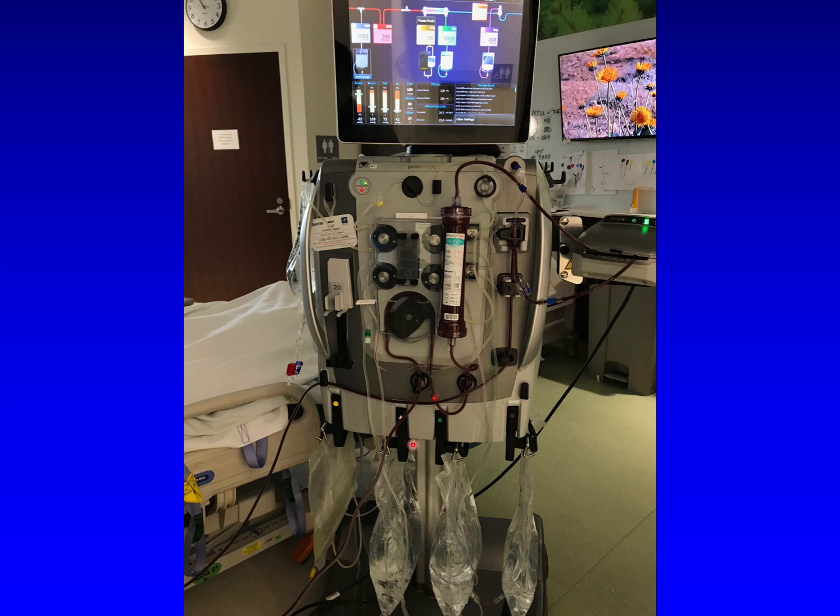Ultrafiltrate is being collected in one bag. This is what's being sucked out of the capillaries as they go through the canister. And notice how this bag is plasma colored, unlike these other bags that are simply mixtures of water and electrolytes. The replacement fluid, meanwhile, which is 2 of these bags, is being instilled both before the filter in the blood circuit and after the filter.